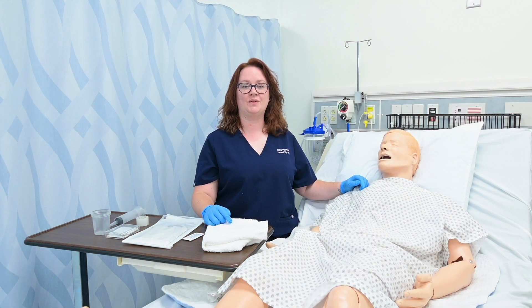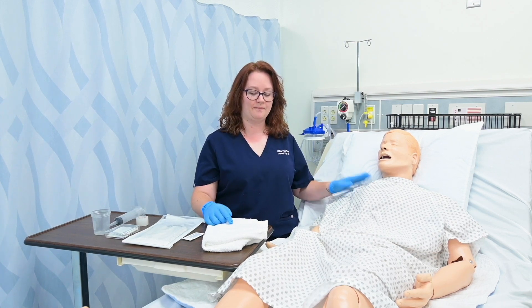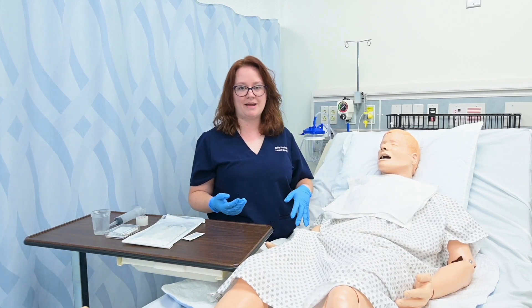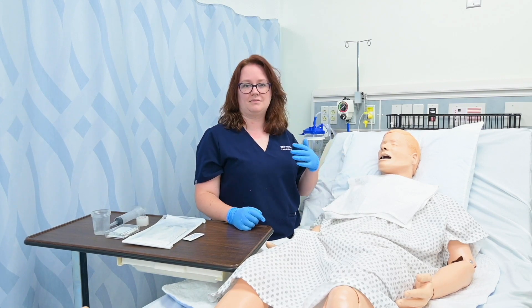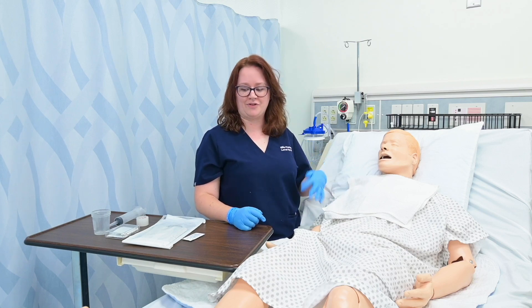To prepare my patient for a nasogastric tube insertion, I've gone ahead and elevated the head of the bed. I'm going to cover their chest with a towel. I could also give them a basin or an emesis basin and maybe even some tissues, because this can stimulate their gag reflex and they might need to gag or potentially even vomit. So I want to make sure we're prepared for those scenarios.